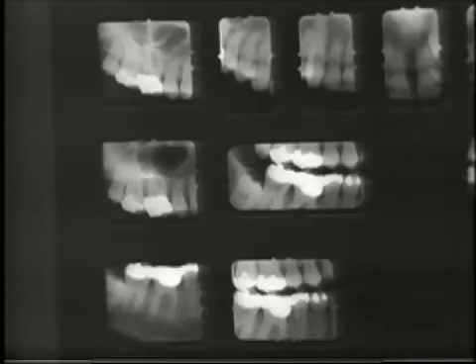The radiographs will give us details as to the morphology of the roots, the density of the adjacent bone, the proximity of regional vulnerable anatomy and pathology, will dictate the pathways through which teeth can be removed, and will therefore provide us with information for technical efficiency.